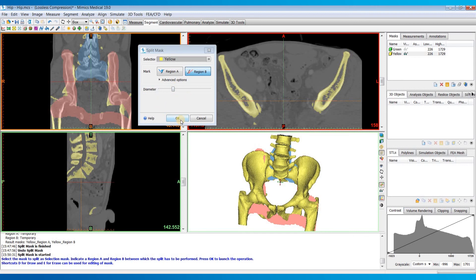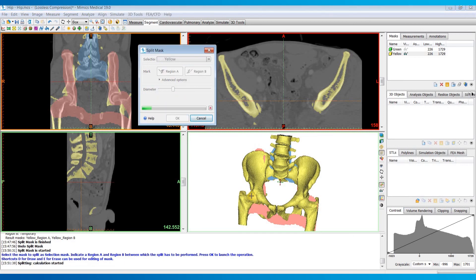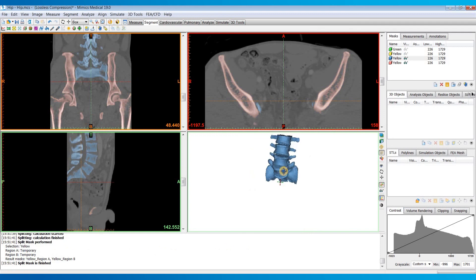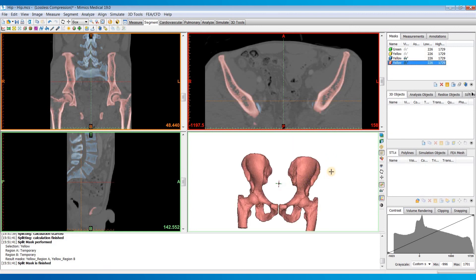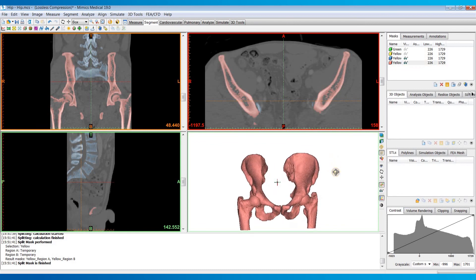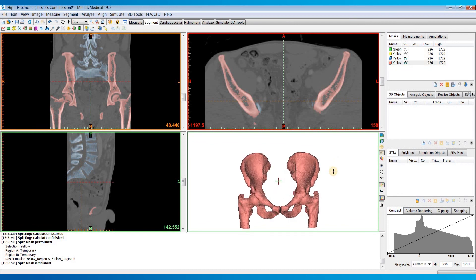I'm going to hit OK. You can see it has split off the sacrum for us — we now have two new masks: the blue one with the sacrum and the red one for region B that contains the pelvis and the femurs.